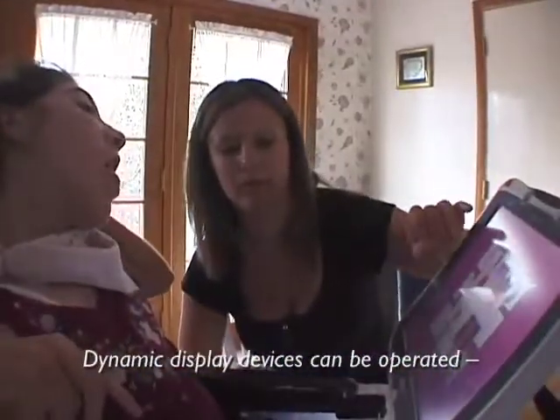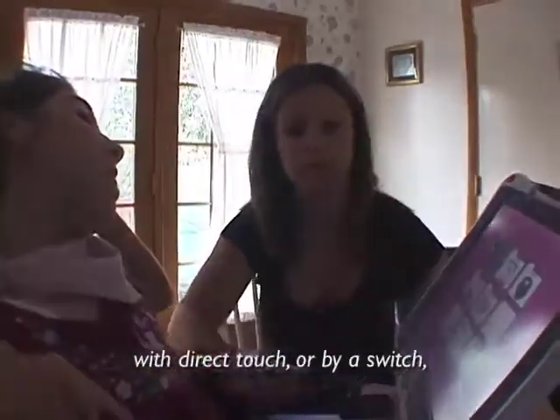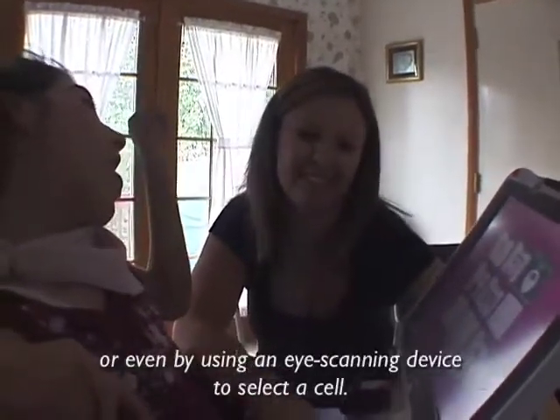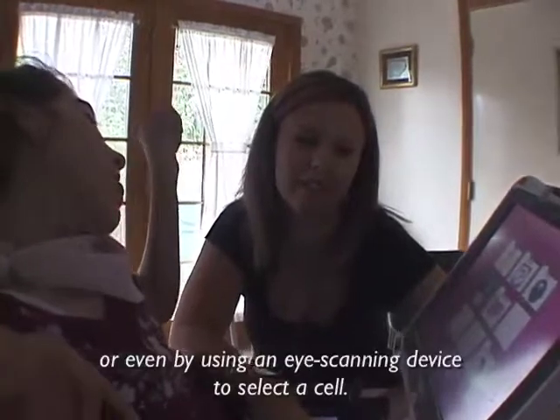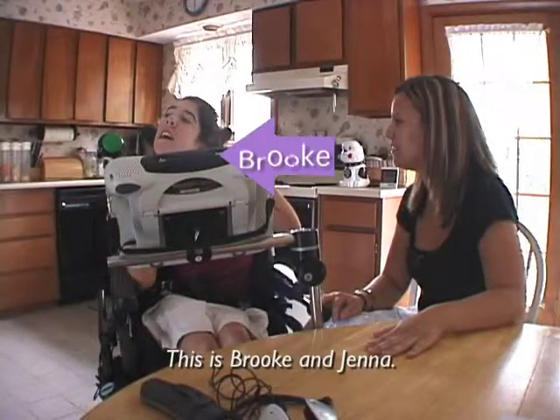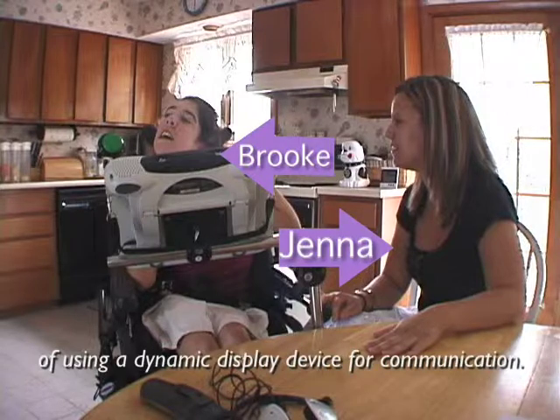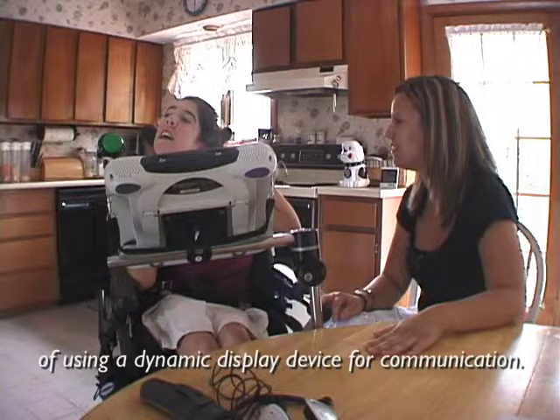Dynamic display devices can be operated with direct touch or by a switch, or even by using an eye scanning device to select a cell. This is Brooke and Jenna. They will demonstrate the pros and cons of using a dynamic display device for communication.